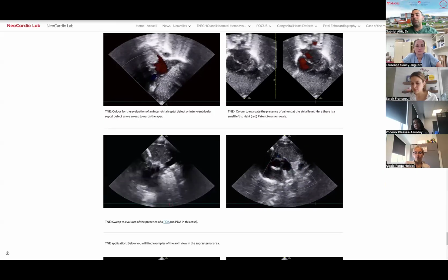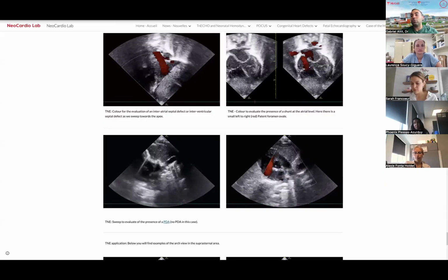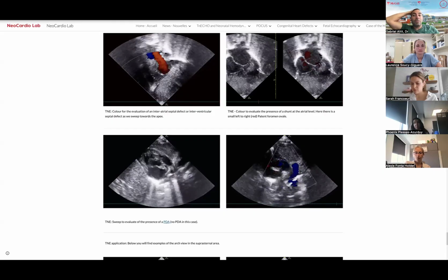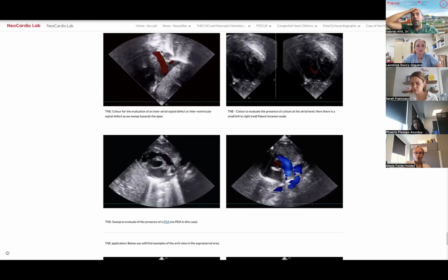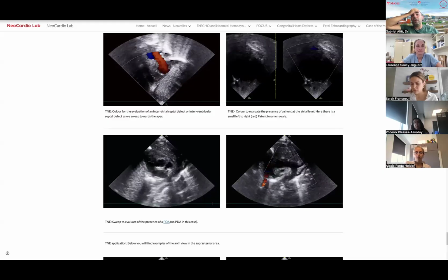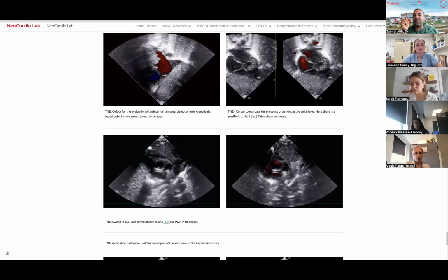So adults that have severe AI, that's one of the signs they're going to be looking at in the echo lab. Do I have retrograde flow in diastole? That's a really bad sign of valvular incompetency. But we can sometimes see it in some of our patients, especially those who had aortic stenosis and balloon valvuloplasty in the cath lab, if they've been a bit too generous. And often that's why they're very careful when they're ballooning these valves.